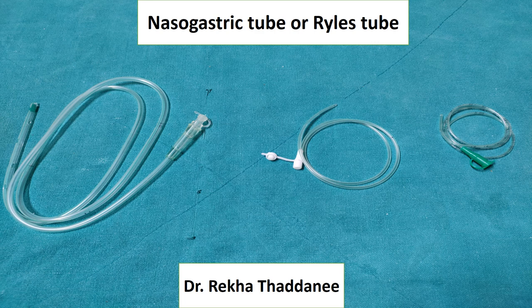Hello everyone, today in this video I will describe the nasogastric tube, also known as Ryle's tube.